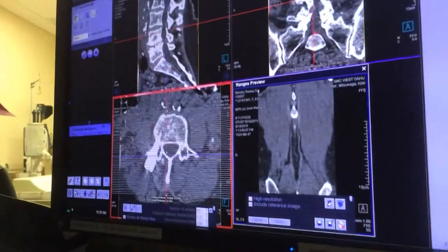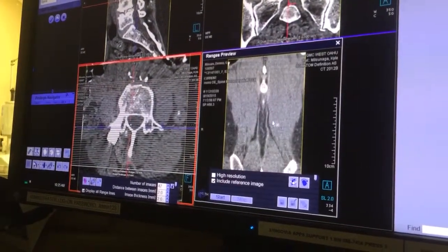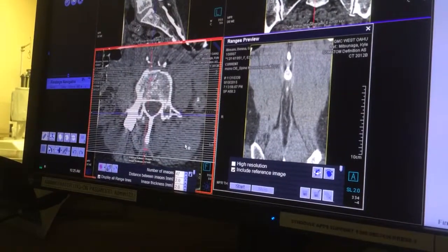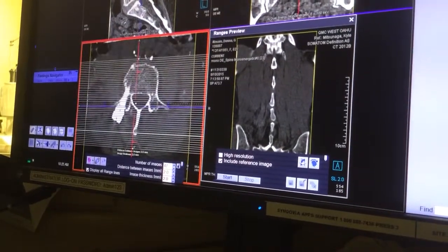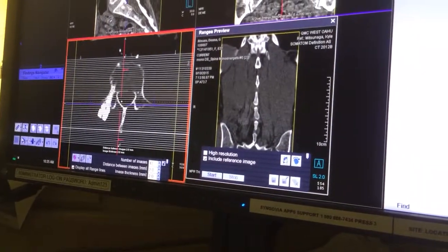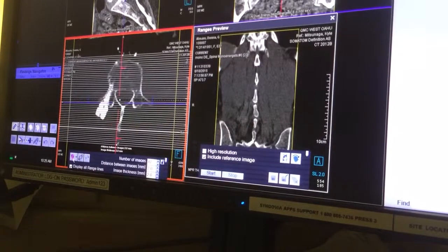That's a coronal soft tissue — it's soft tissue, not bone. So if you want a bone window, you can either window it — take your middle mouse and do this with it. Or you can use the other recon that you have if you want a sharper recon with the bone already on there. Then you can hit start again.